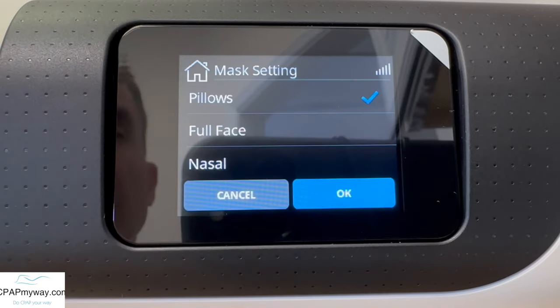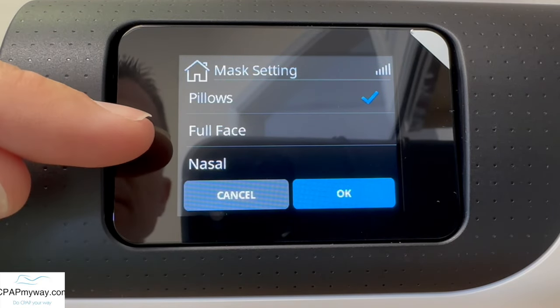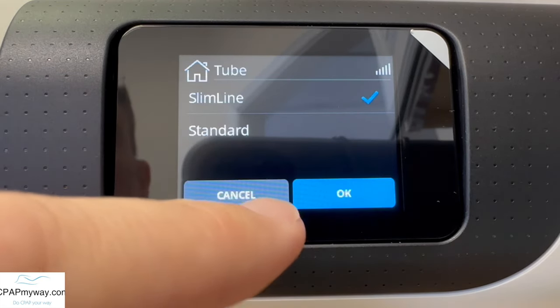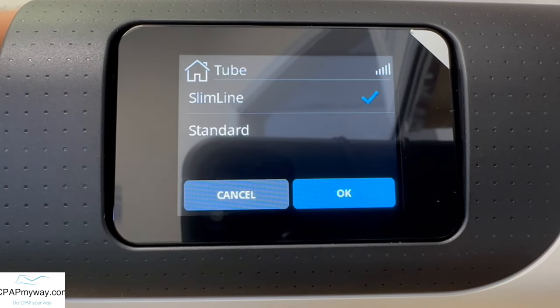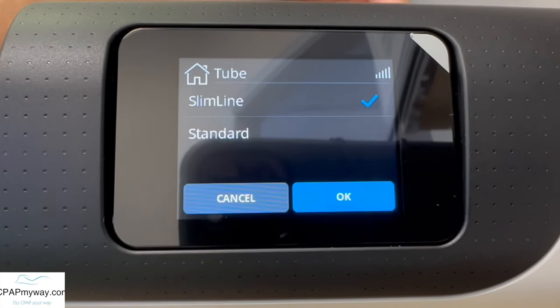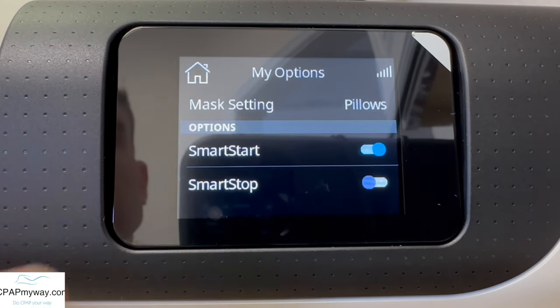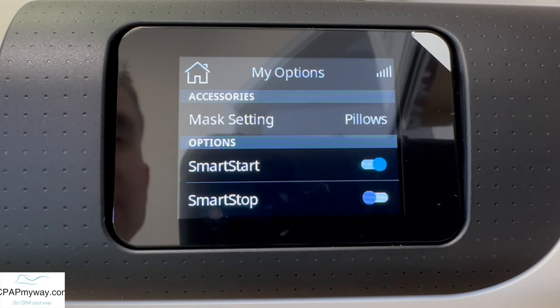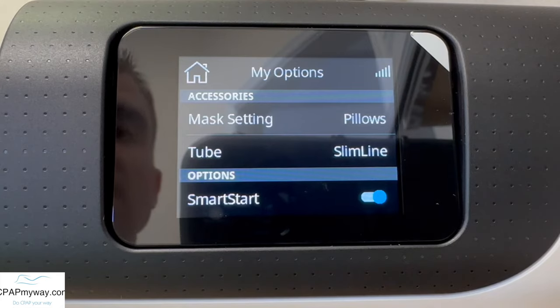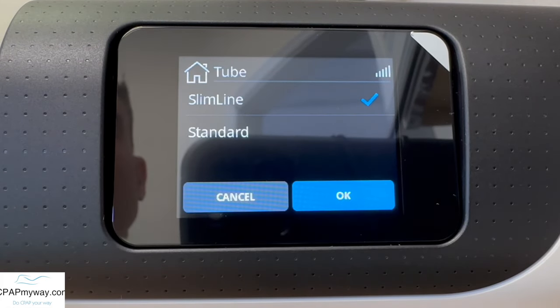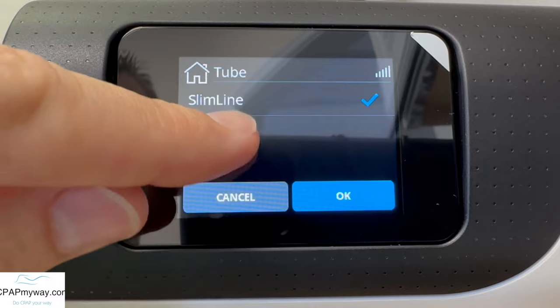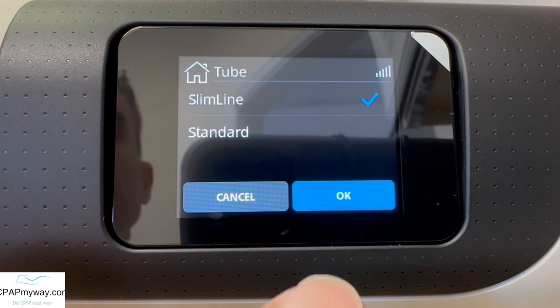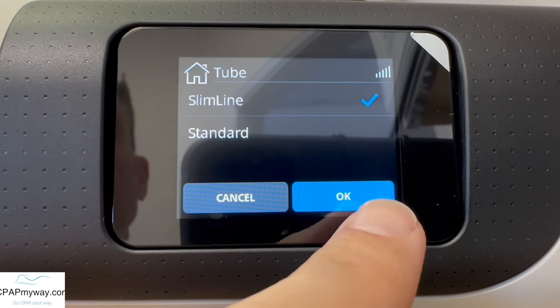Scrolling down, you'll see your mask setting. You've got three options: nasal, full face, and pillows. Whatever mask you're using, make sure you put that in there. Tube is going to be slimline unless you have the actual climate line tube attached. If your climate line tube is attached, that option goes away because it knows what tube is connected. When you have it disconnected, you can pick between slimline or standard. Standard would be a 22 millimeter tube; slimline is the 15 millimeter tube. Most people are getting a slimline as the standard option with the AirSense 11.